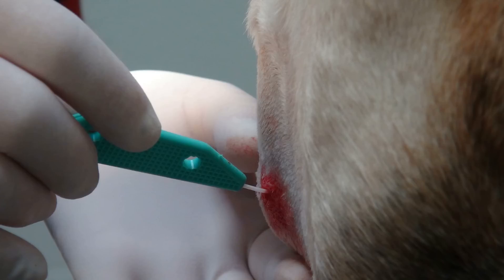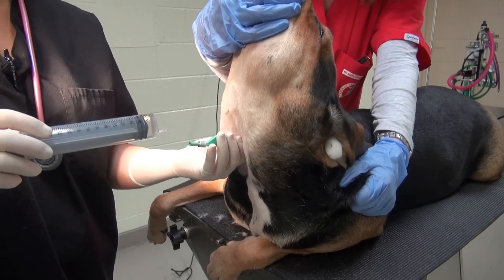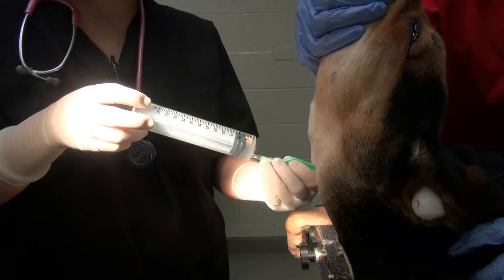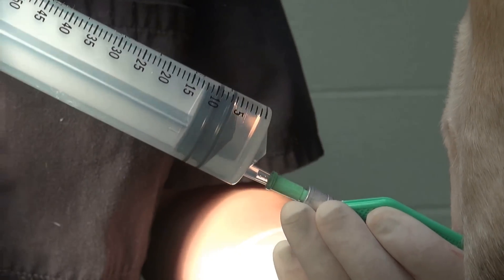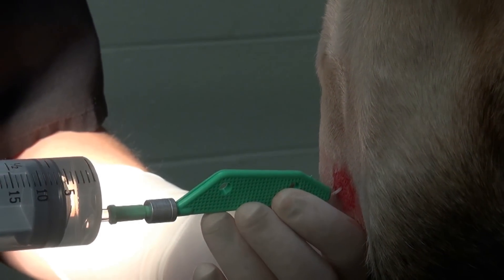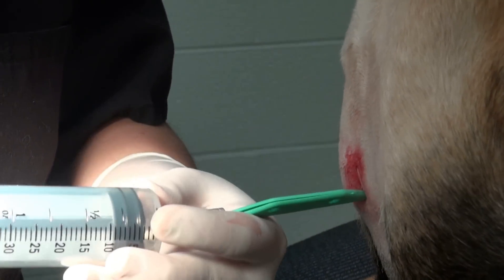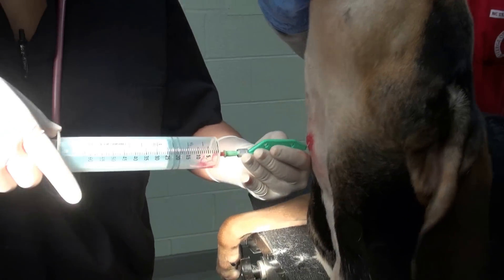Connect the syringe with saline to the catheter hub and perform the first injection of approximately 5 ml of saline in a large syringe. Inject the entire amount rapidly and immediately begin aspirating. If you have trouble injecting, the catheter may be kinked at the point of insertion. Pay attention to kinking at either the clamshell exit or skin entrance, straighten the junction, and then inject freely and immediately aspirate. If you can't aspirate, again check for kinks.